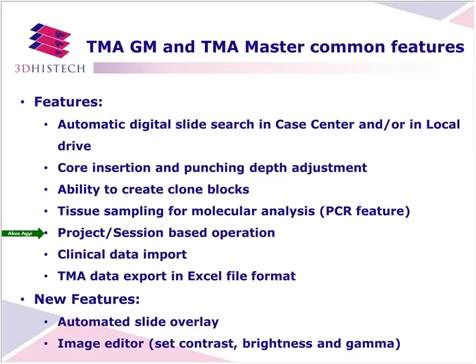Both systems have project or session-based operation. This means that every TMA data is saved to a database, and the user can stop the TMA project and can load back this project later and can continue the TMA project. Moreover, in the unlikely event of power shortage, there is no problem because the system can recover from the database and can continue the TMA project from the moment where it was interrupted.